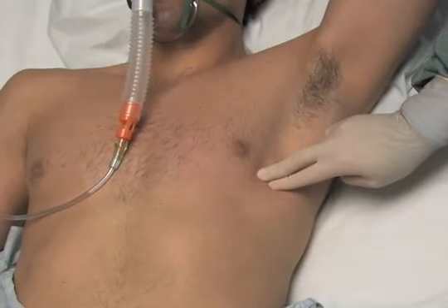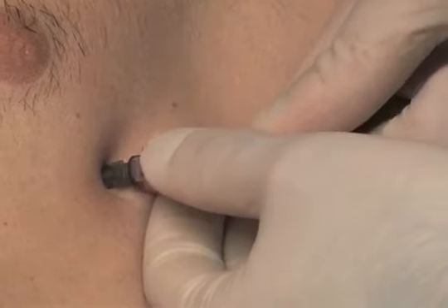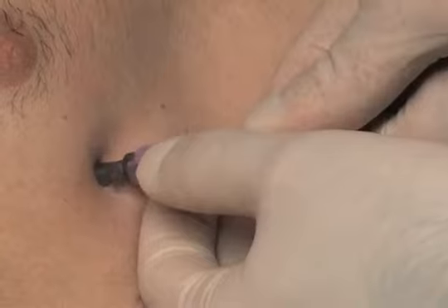The incision will be made here. The chest tube will actually be inserted 1 interspace above this point. Mark the incision spot with the imprint of the back of a needle or a pen marking.